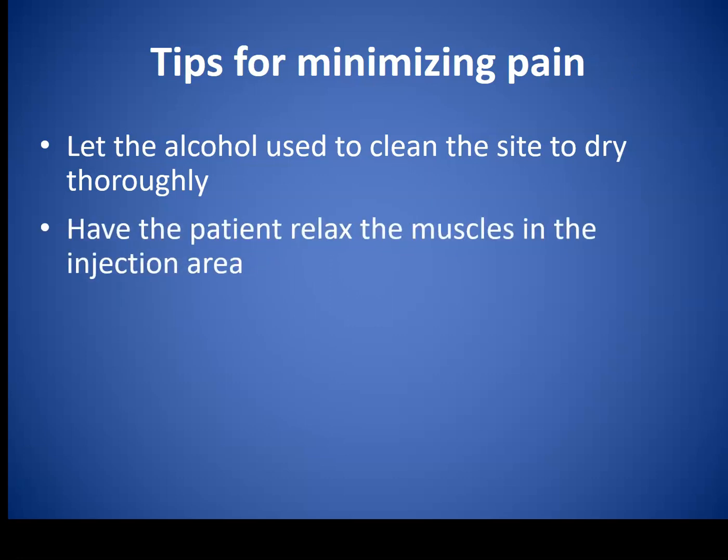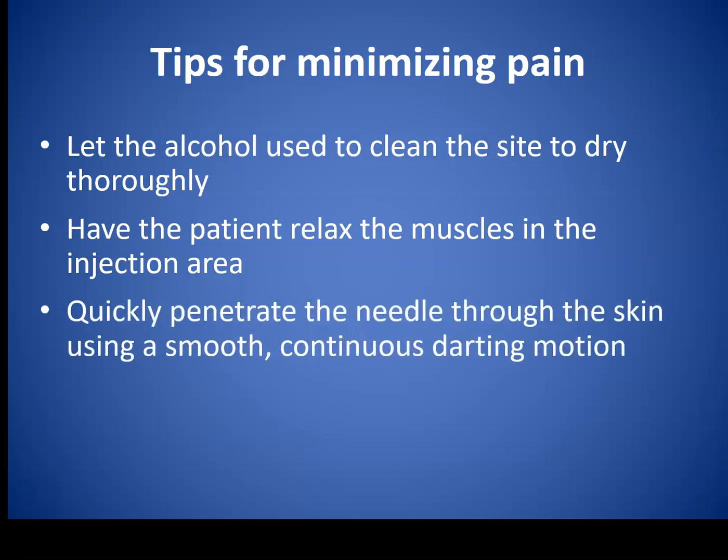Always make sure the patient's relaxed and that the muscle in the injection area is relaxed. If it's tensed or contracted, stop and help the patient relax. Sometimes I have to put my hand on the patient's shoulder if they've got their arm tensed up and give them almost like a little massage to help them relax. A lot of times people have no idea that they're doing this.